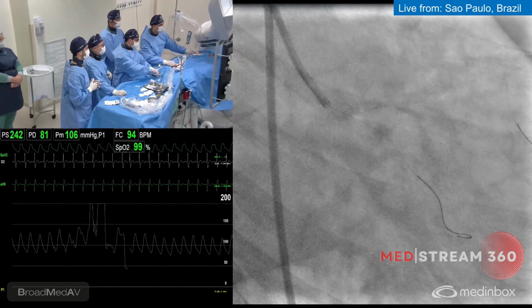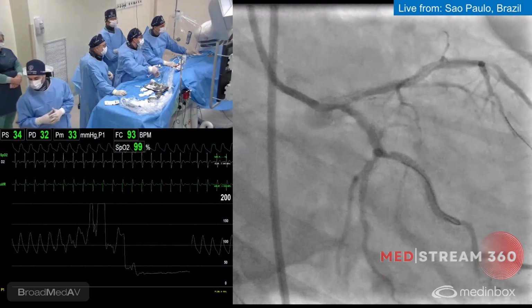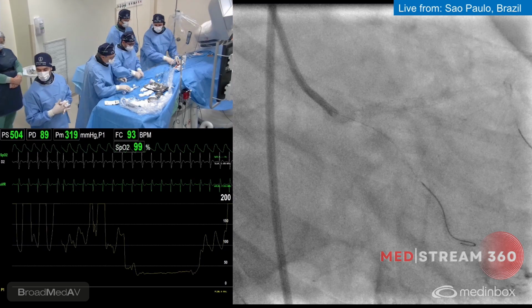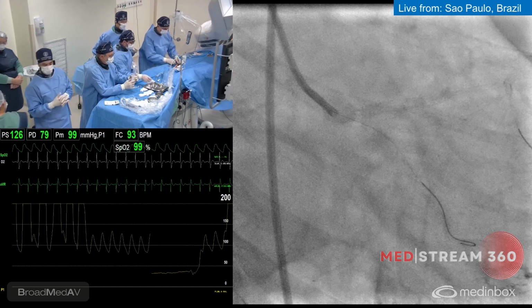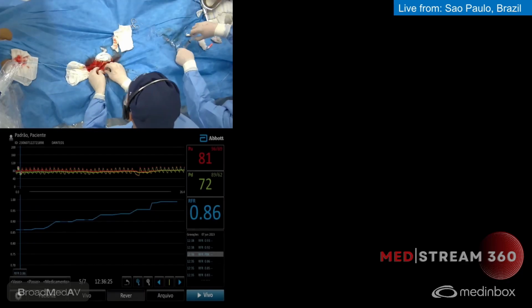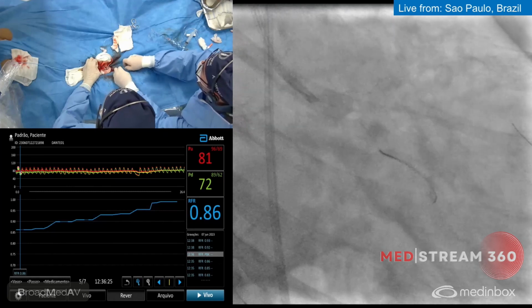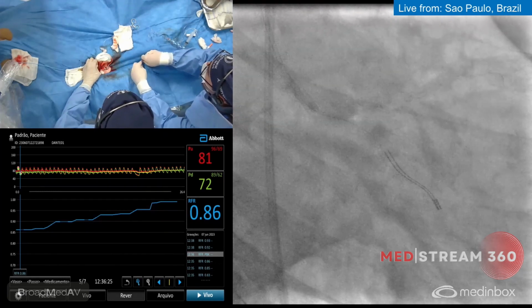So you're bringing back the balloon and you're going to do a control angio now. Bring the guiding catheter. Okay, great, we like the position very much. So Fausto, I think we're ready here for IVUS control. Can you do FFR? We can try to do it, yes. Let's do FFR. May we have FFR on the screen? While they are preparing the IVUS, just to save time, Ricardo, can you do it? Yes, of course. After you take the balloon off, maybe you can just repeat the angio.